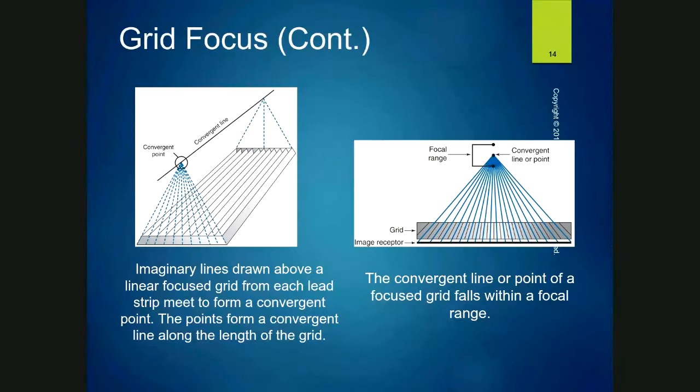This is also the reason, for those of you who have been to Rockingham, that main x-ray room that they use at RMH, they don't have a grid that changes to a 40-inch grid from what I've been told. And that is why they use the same grid and they do all their exams at 72 inches in the Wall Bucky, because they don't have a 40-inch grid for the Wall Bucky. So that's that about grid focus.